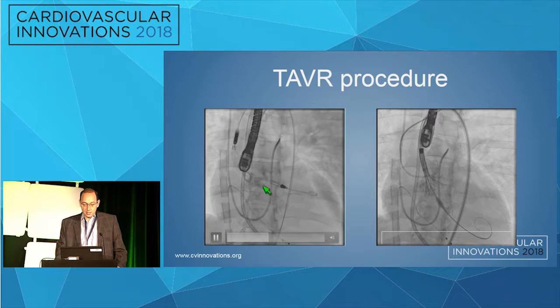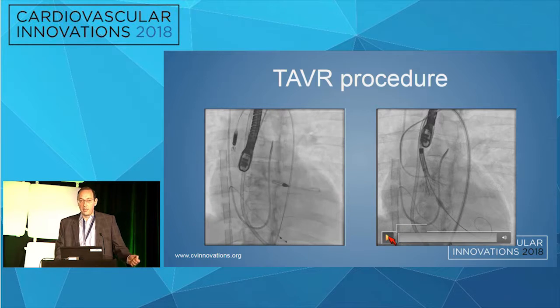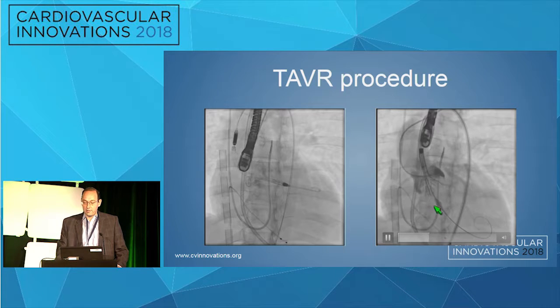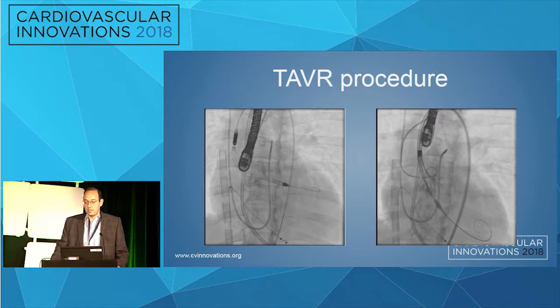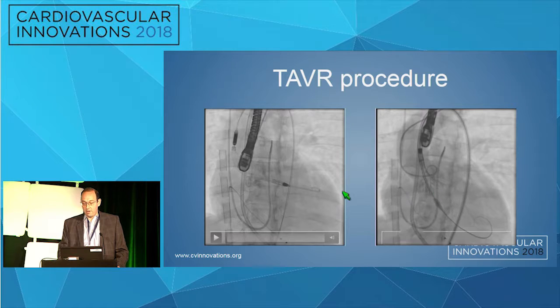The valve is bulky and is heavily calcified, as you can see. We pulled the Impella out, and we put the Evolut in, and we did not have a problem crossing that valve, luckily. This is a problem that we did not want to have during this case. And actually, it was very interesting. We ramped the ECMO flow up, so it's kind of like we're doing rapid pacing. There was very little contractility, and the valve deployment was very steady. As you can see, we unsheathed that valve pretty quickly, and we had a functioning valve.